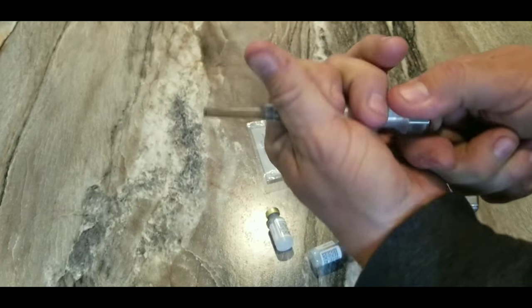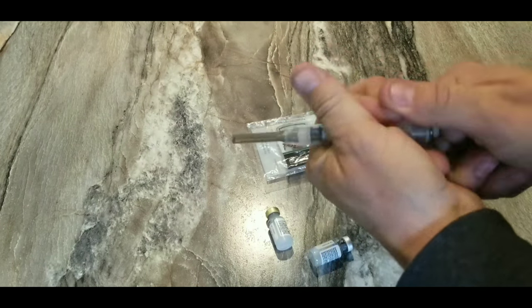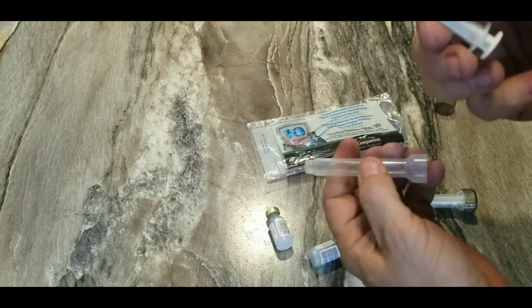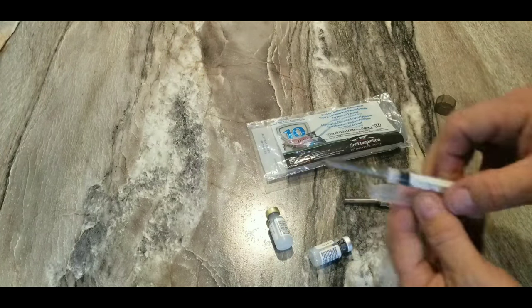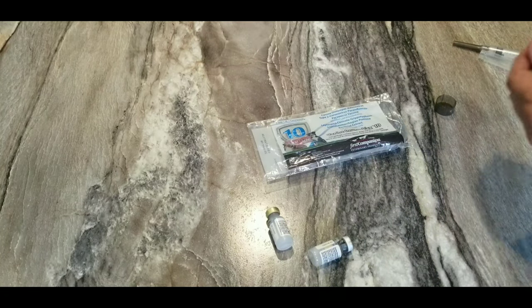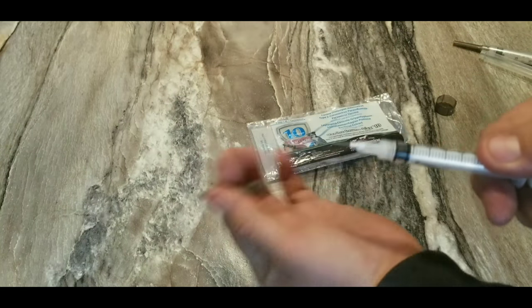It's very easy to do. This is the hardest part — getting this apart. Voila, you have a needle. It's just that easy. Pull the end off right here.